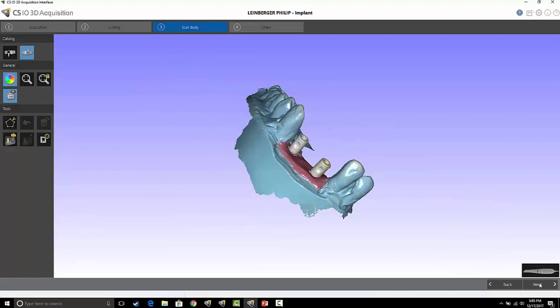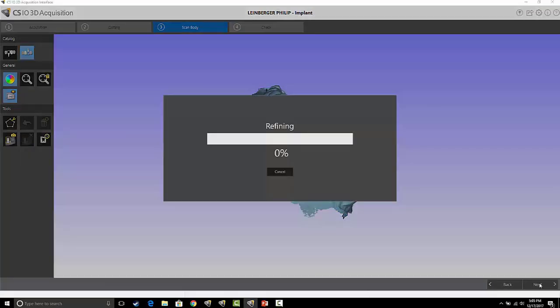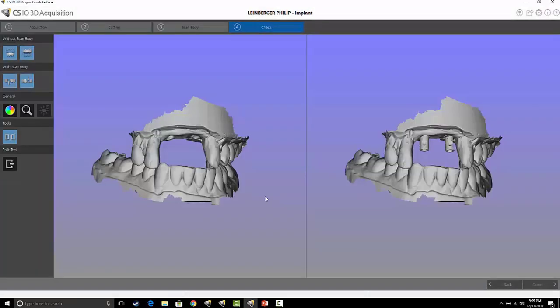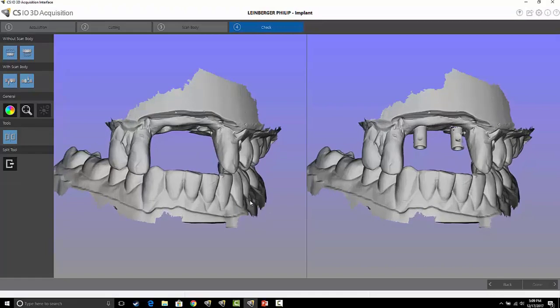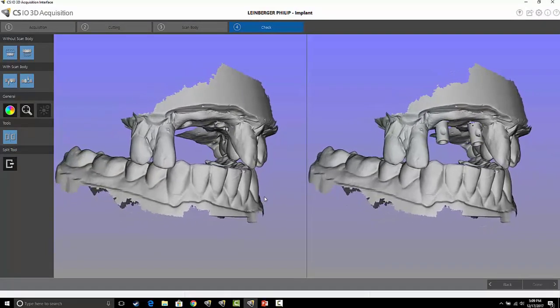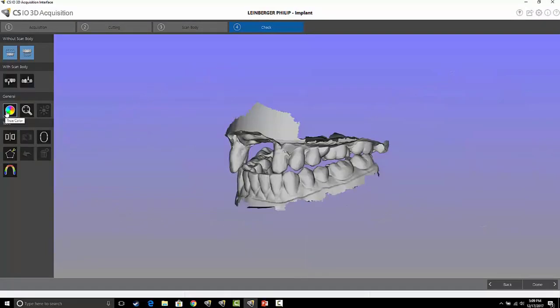You refine like normal, and here's your two models with and without the scan body. You can save like normal. Hope this helps.